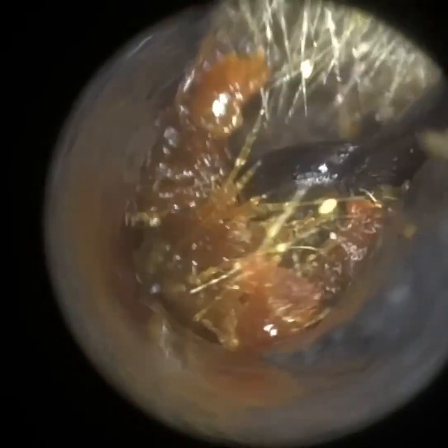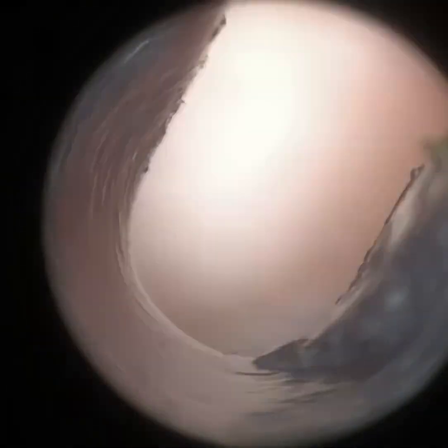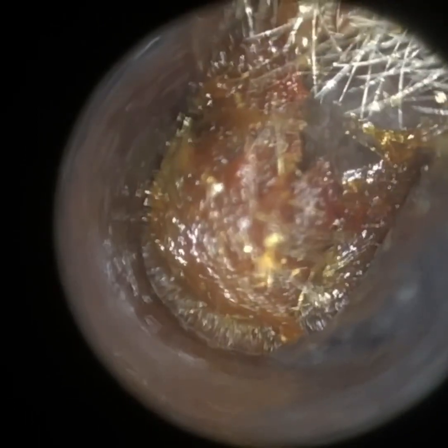I'm just going to stretch the ear open again. Trying to use a Jobson horn, getting in behind. The Jobson horn got some of it out, but it also squashed some of the wax at the base of the ear canal — it's almost like spreading it like butter. So I've just gone back in with the suction probe, lifting up and away.